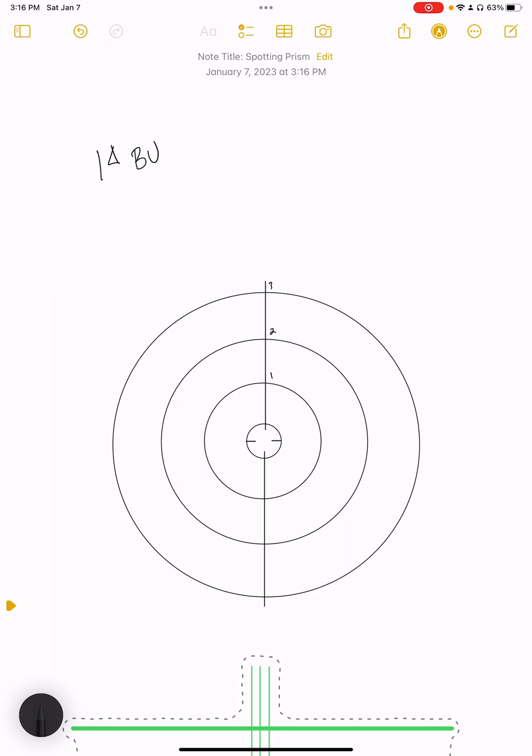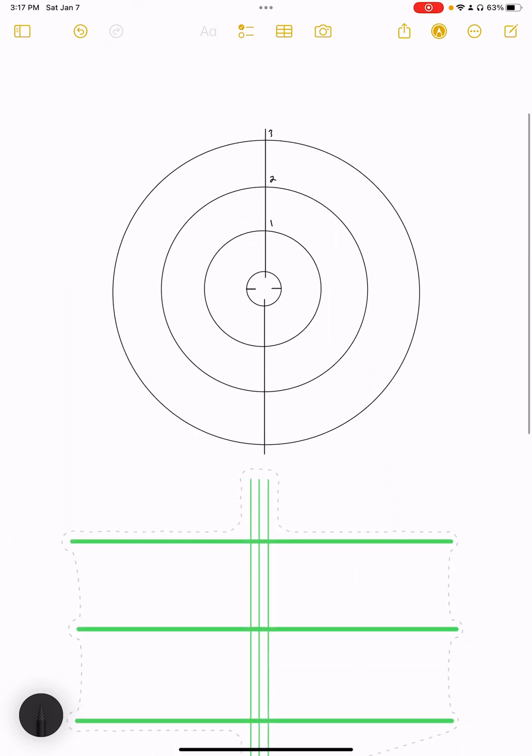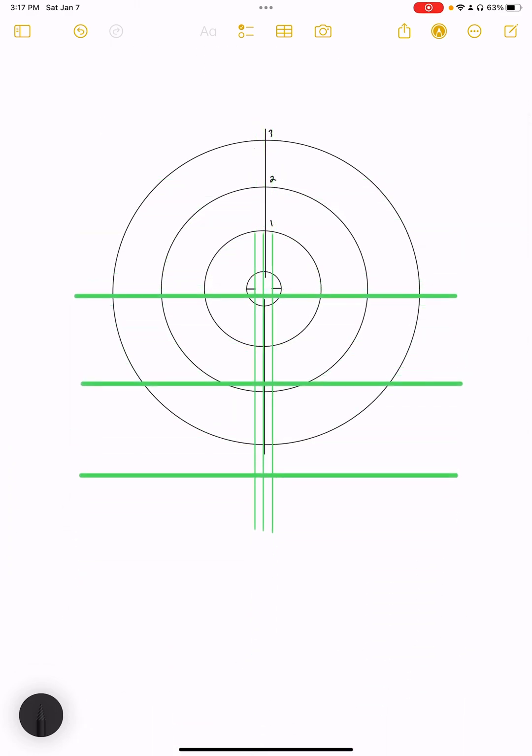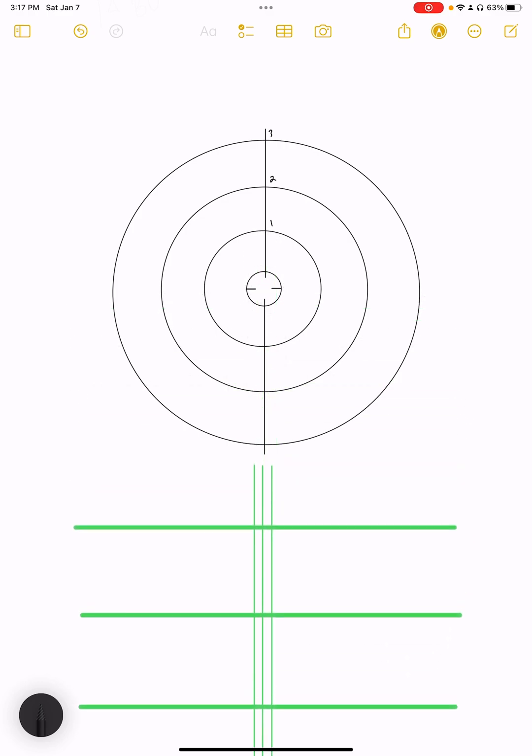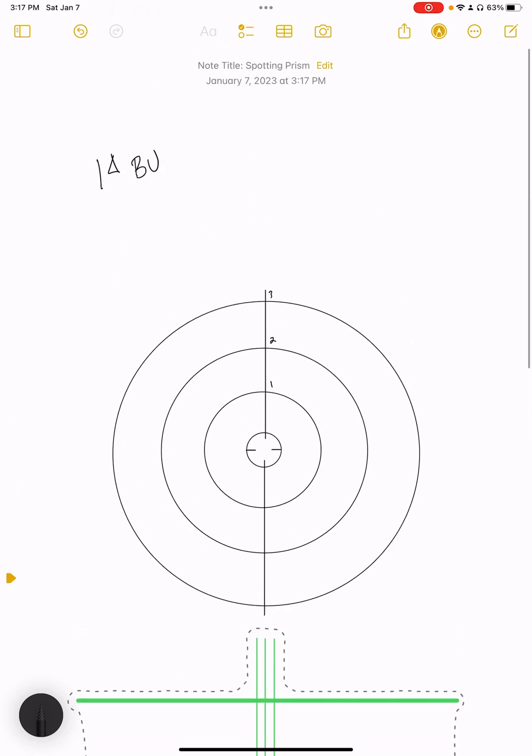Where would you align the target for two diopters base down? Hold your finger there or picture it in your mind's eye. If you said right here at the two-diopter ring downward, you'd be right. That's the same whether it's the right eye or the left. Now let's do horizontal prism.